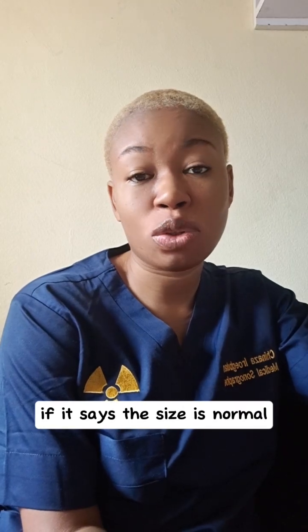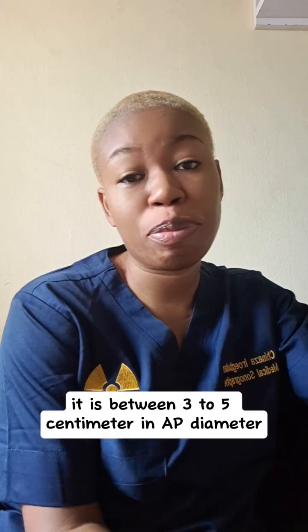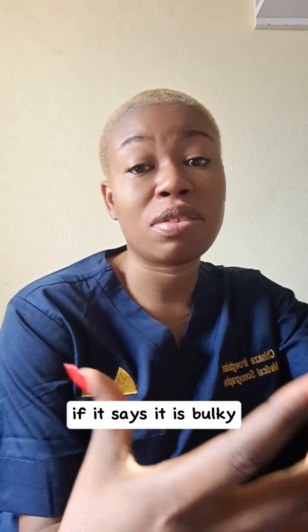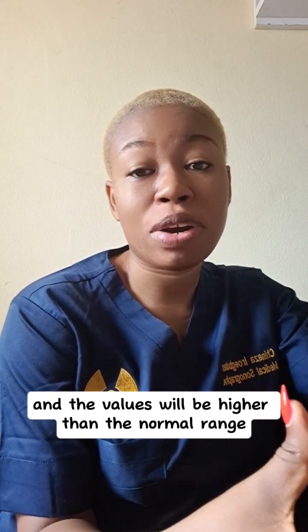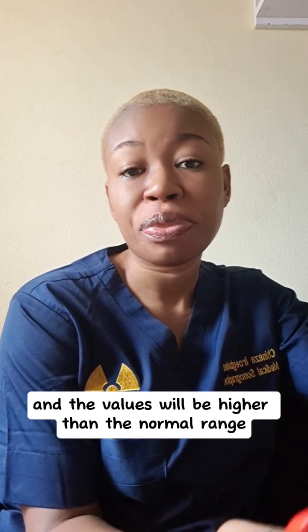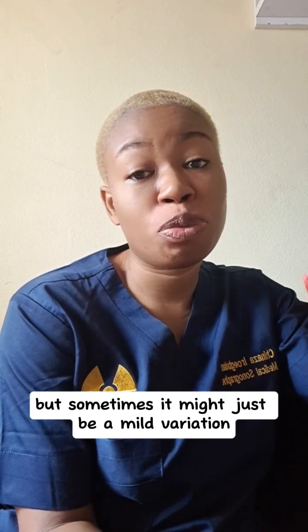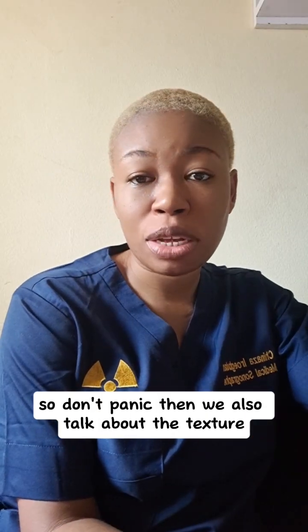Next, you may see something like the size of the uterus. If it says the size is normal, that's fine. That means it is between 3 to 5 centimeter in AP diameter and it is less than 8 centimeter in length. If it says it is bulky, it simply means the uterus is slightly enlarged and the values will be higher than the normal range. This can be due to things like fibroids or adenomyosis, pregnancy, but sometimes it might just be a mild variation, so don't panic.